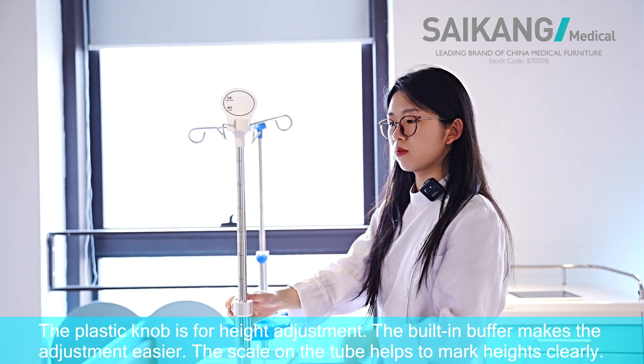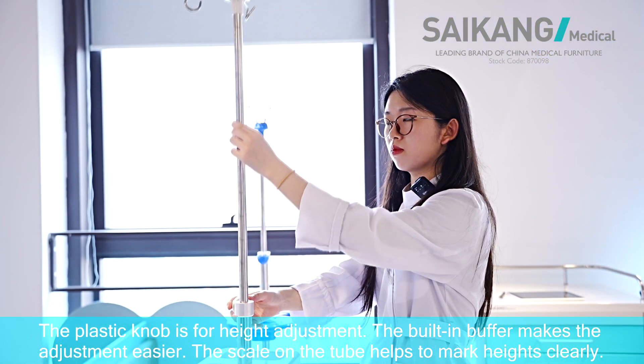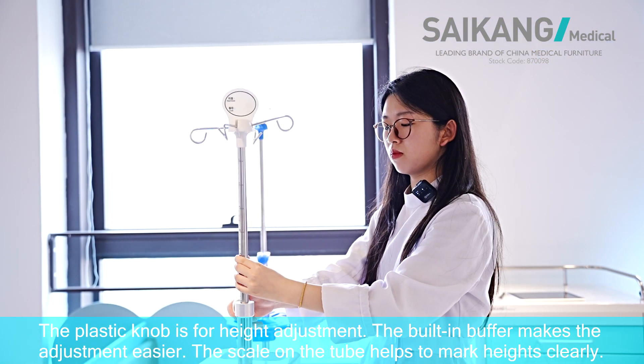The plastic knob is for height adjustment. The built-in buffer makes the adjustment easier. The scale on the tube helps to mark height clearly.